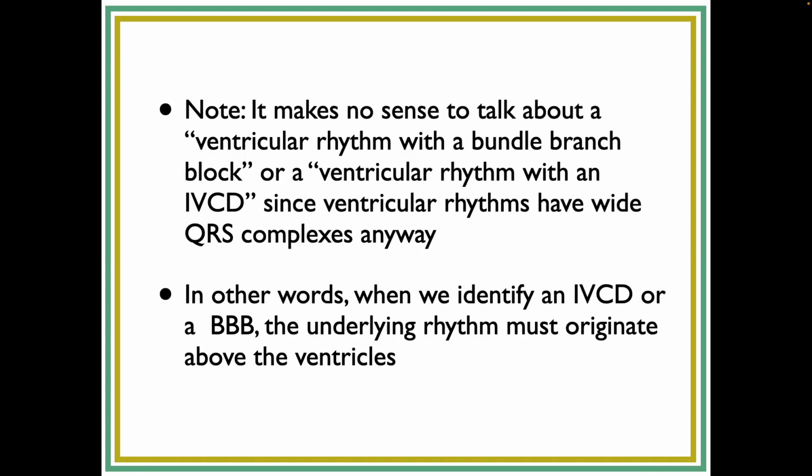Now, both ventricular rhythms and supraventricular rhythms with the IVCDs have wide QRSs. And people get that mixed up sometimes, and they'll look at a ventricular rhythm and they'll say, oh, it's accelerated ventricular rhythm with an IVCD. That doesn't make any sense, okay? A VTAC is always wide.